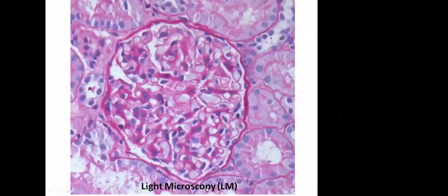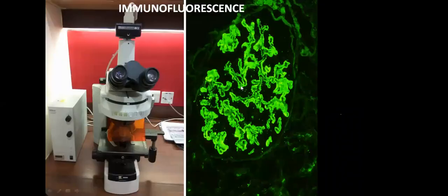So just to highlight, this is light microscopy, how a glomerulus looks. This is a PAS stain, so you can see the capillary loops and the intervening mesangium, and these are the nuclei in the mesangium. One or 2 nuclei means there is no mesangial hypercellularity. It is a normal looking glomerulus with a Bowman's capsule, and these are the tubules. Whenever we report any kidney biopsy, we always look at 3 compartments: the glomerular compartment, the tubulointerstitial compartment, and the vascular compartment. Then the second modality is immunofluorescence.